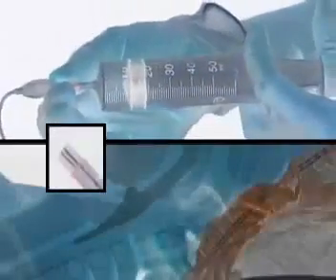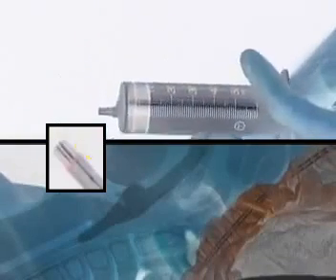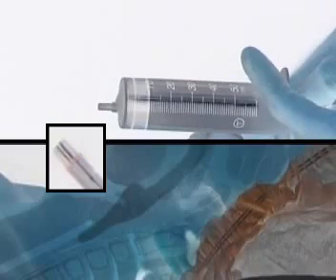And there you see it, following the natural curvature, with the finger going as far as it can, and then using the other hand to stabilize the laryngeal mask as you remove the introducing finger. Then with a pre-prepared syringe, inflate the correct volume. You will notice that not only is the cuff inflating in the pharyngeal cavity, but the connector is also rising slightly, which is an indicator that the laryngeal mask has been fully inserted.